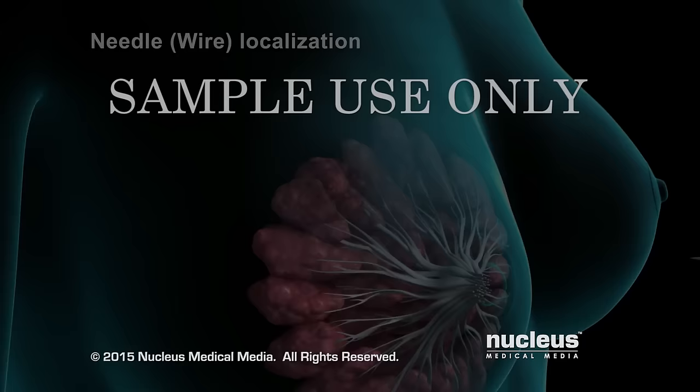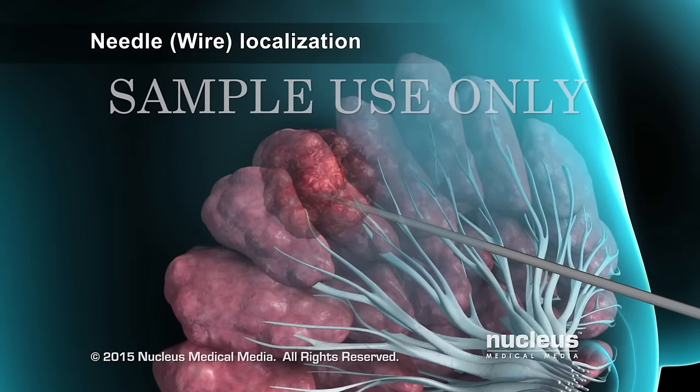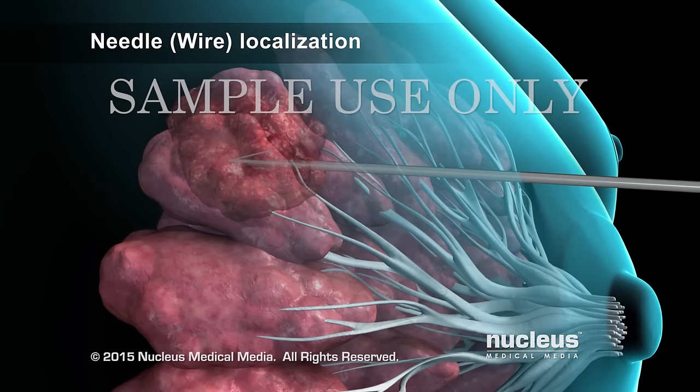If the abnormality cannot be felt, needle localization will be used to mark the location of the area of concern. During this procedure, your radiologist will insert a hook wire into the breast through a needle under mammogram or ultrasound guidance in order to mark the area. The needle will be removed, but the wire will stay in place.